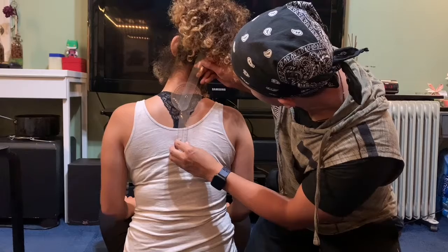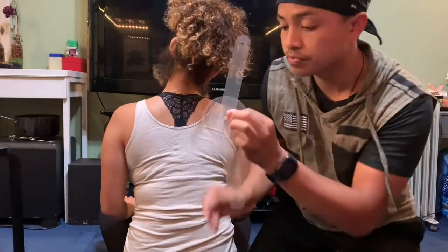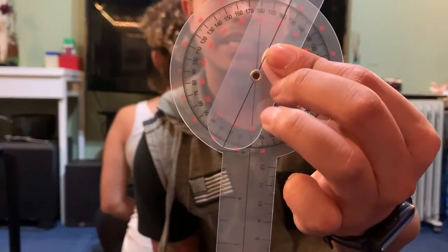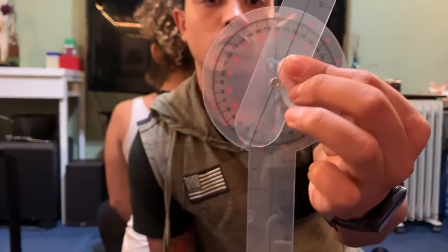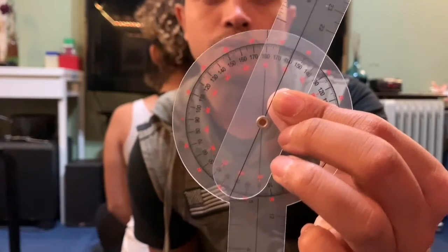Let the motion go. We started at 180 degrees and now it's at 160, which means that her lateral flexion of the cervical spine is at 20 degrees.